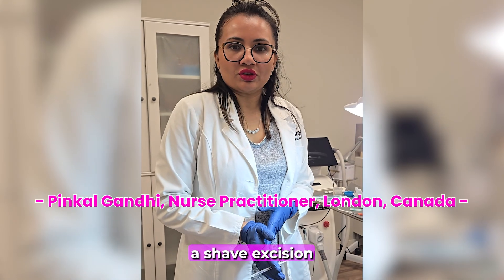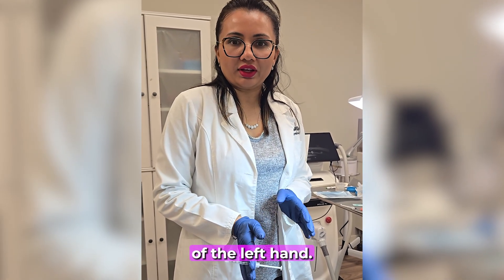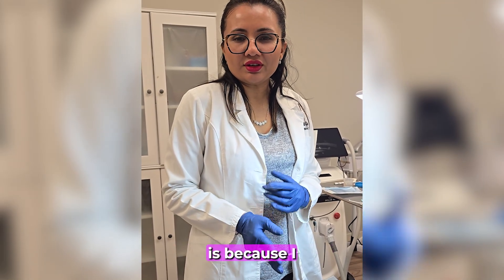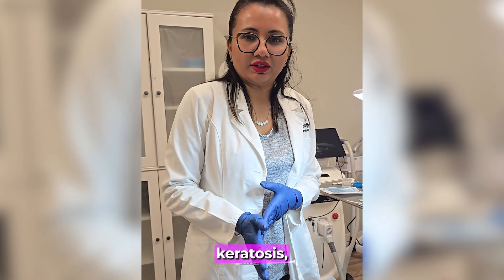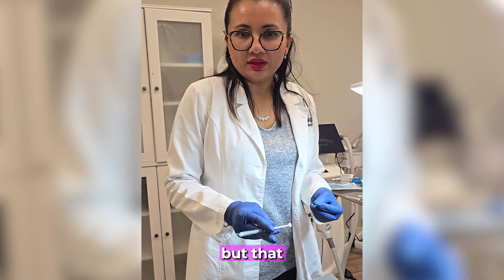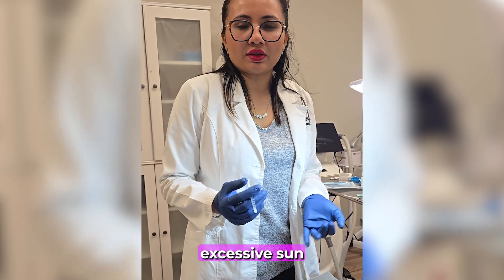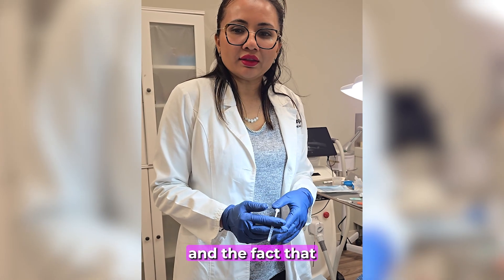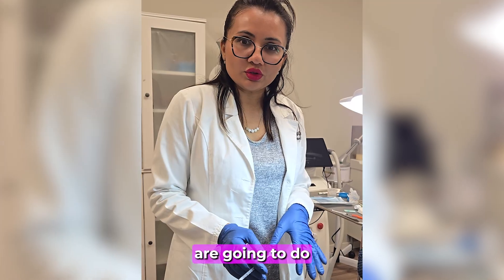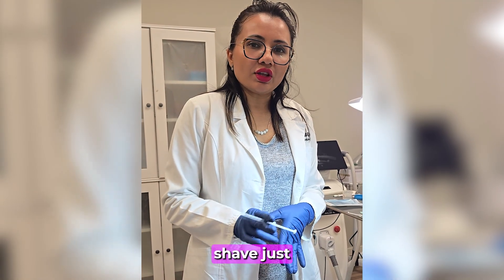Today we are going to be doing a shave excision of a couple of lesions on the back side of the left hand. We are removing it via shave excision because I have a suspicion it might be actinic keratosis, which is a precancerous lesion. It could be something like eczema, but that is my differential diagnosis. Because of the history, the excessive sun exposure in the past, and the fact that it doesn't go away, my suspicion is it might be actinic keratosis. We are going to apply some local anesthesia and then shave just the superficial layer.